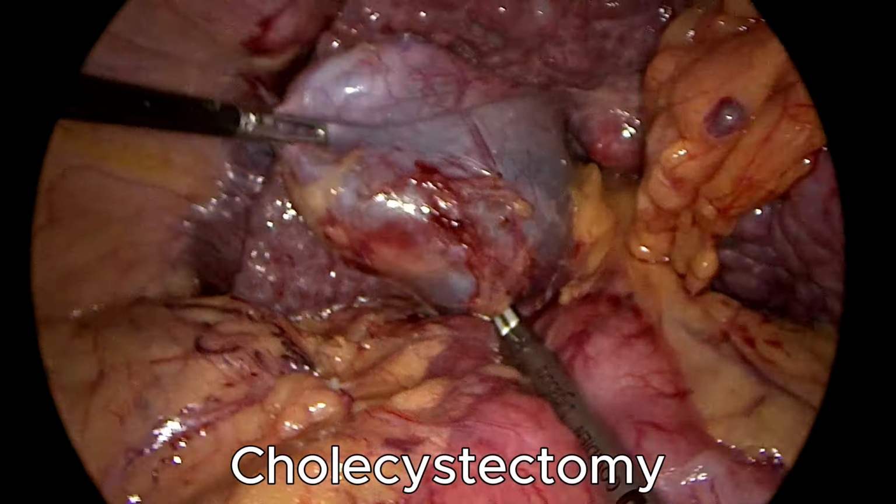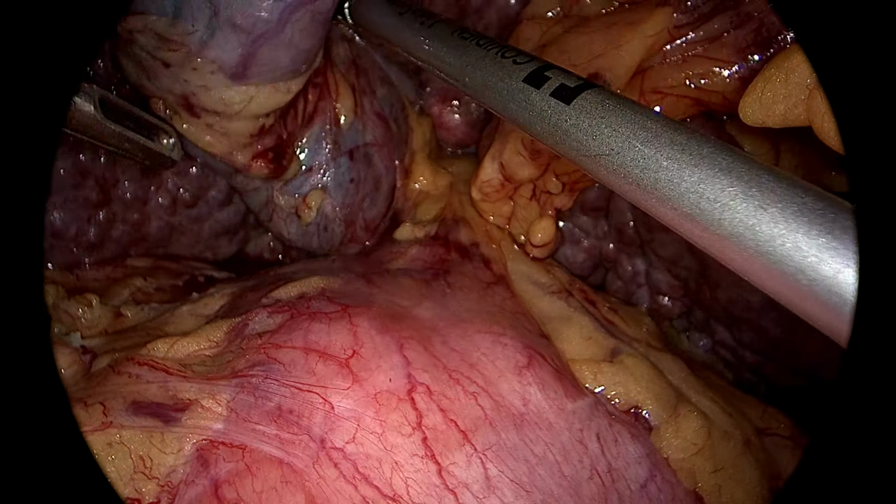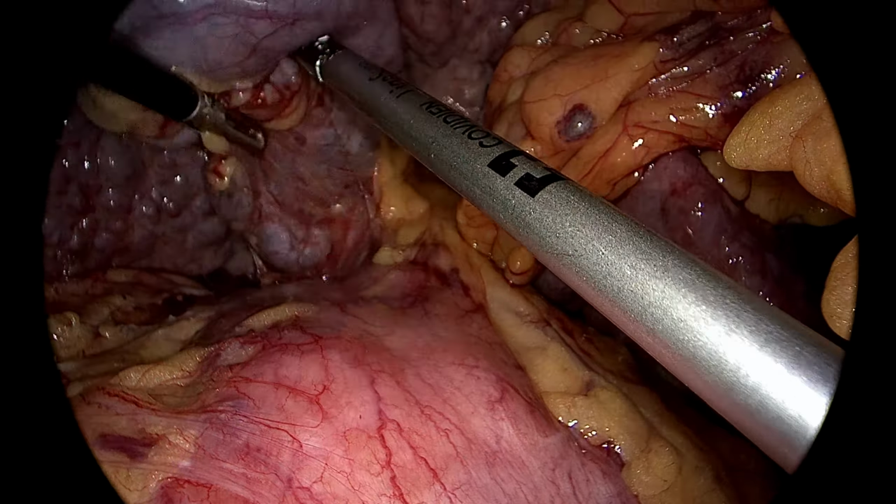We now begin the cholecystectomy. The gallbladder is carefully dissected from the liver bed after confirming the critical view of safety at the cystic duct and artery. Cystic duct and artery are clipped and transected. We will leave the gallbladder in place for now and remove it later.